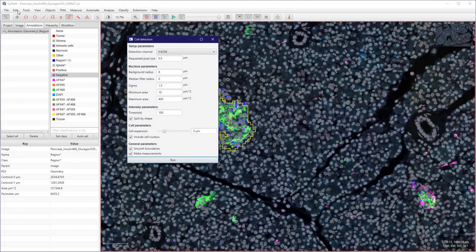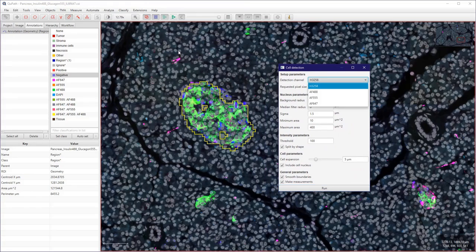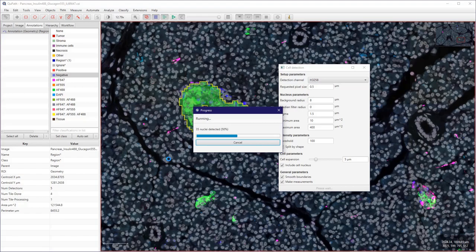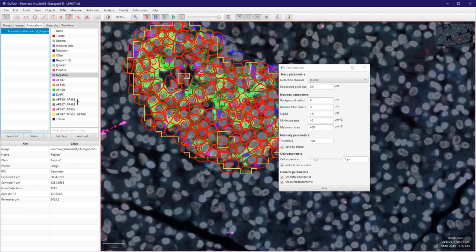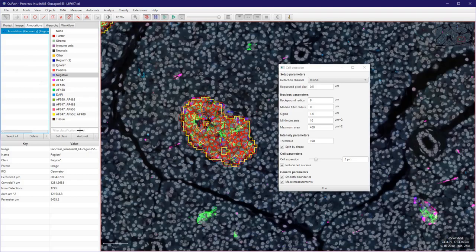And we can use the first channel here to detect cells. So let's run this quickly. I just left the default values, but here I know that this worked pretty well.